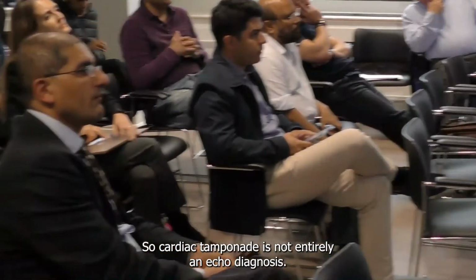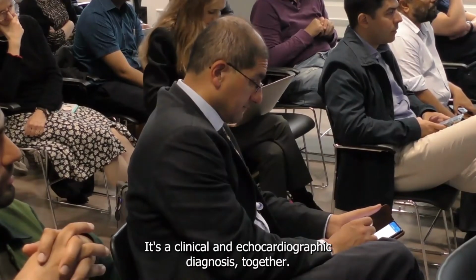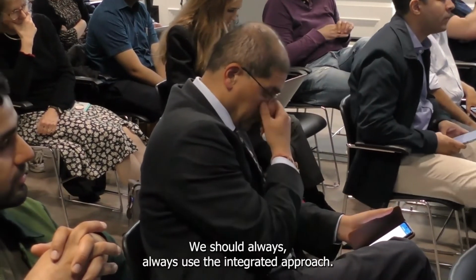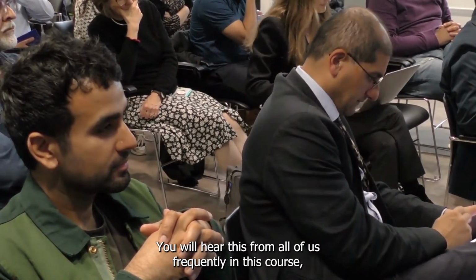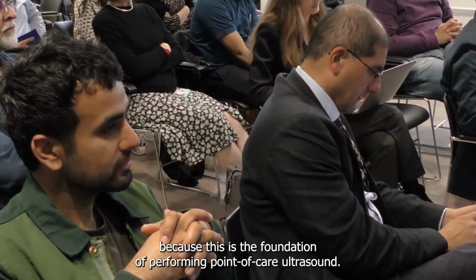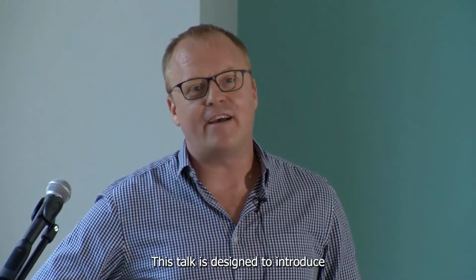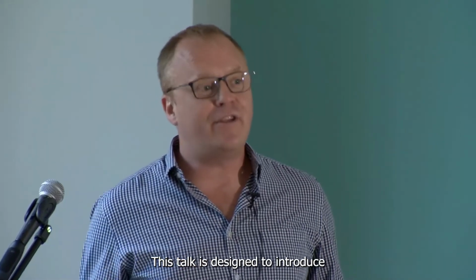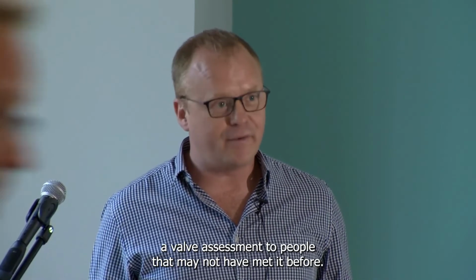So cardiac tamponade is not entirely an echo diagnosis, it's a clinical and echocardiographic diagnosis together. We should always use the integrated approach. You will hear this from all of us frequently in this course because this is the foundation of performing point-of-care ultrasound. This talk is designed to introduce valve assessment to people that may not have met it before.